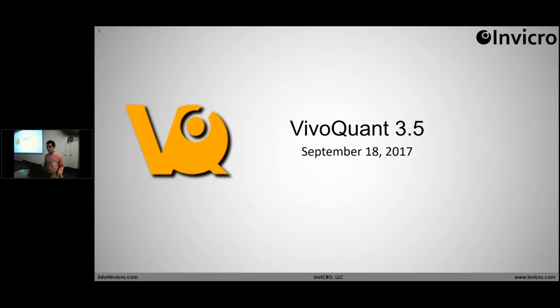If you haven't seen already, VivoQuant had a recent release, version 3.5, with a variety of maintenance and new features integrated in. We had a really good Vivo scripting session with it yesterday, as Bill mentioned, and I'm going to talk a little bit about the release, a little bit about our future directions, and I'll do a little bit of a demo to show some of what we've been working on, and showing off some of the good work of the development team, as well as, of course, our testers and users who provide us with the feedback that drives what we do.